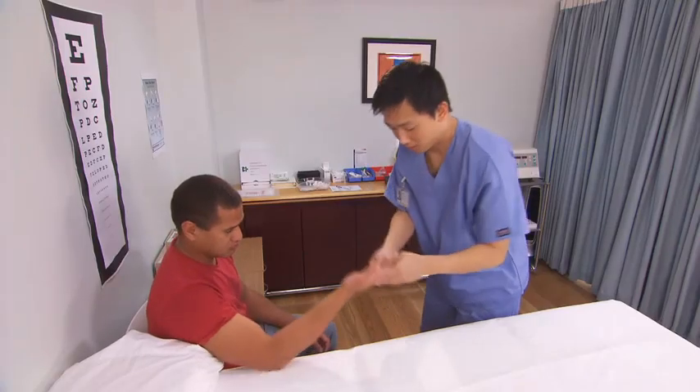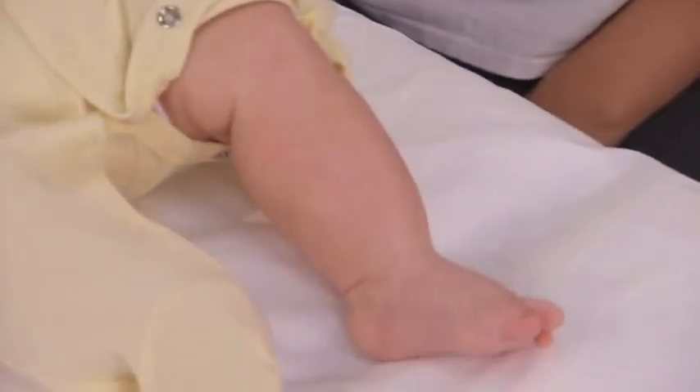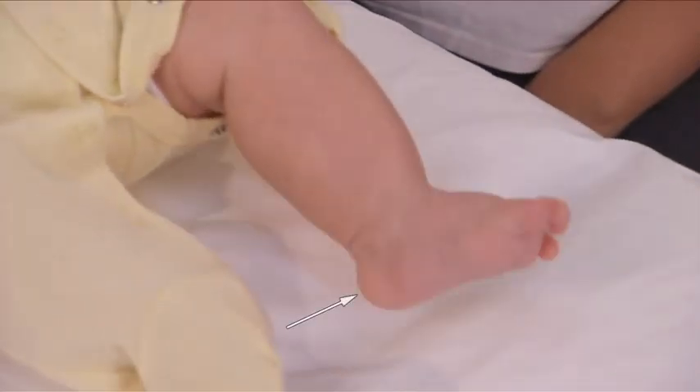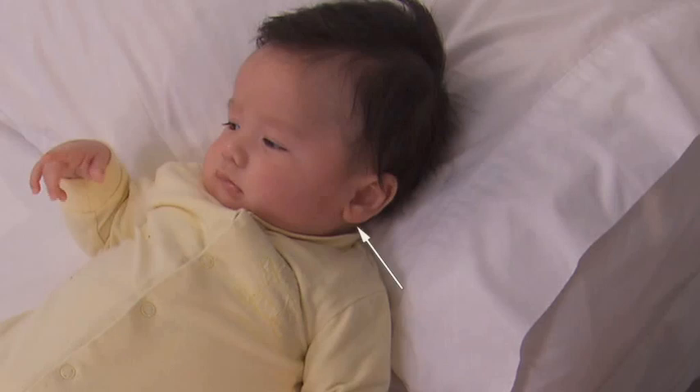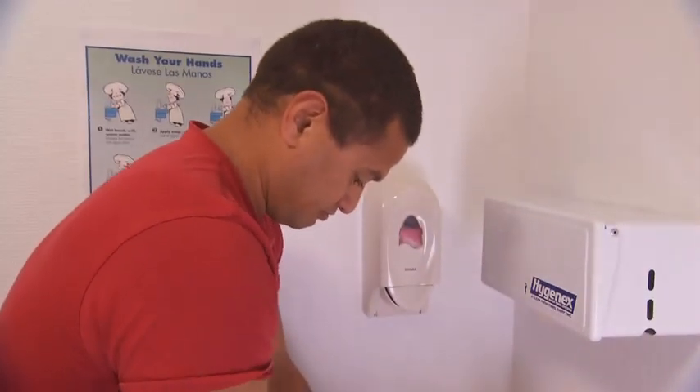Select the appropriate collection site and consider the age of the patient. For children, the heel is commonly used, or alternatively, the earlobe can also be used. If performing a glucose test from the finger site, instruct the patient to wash their hands.